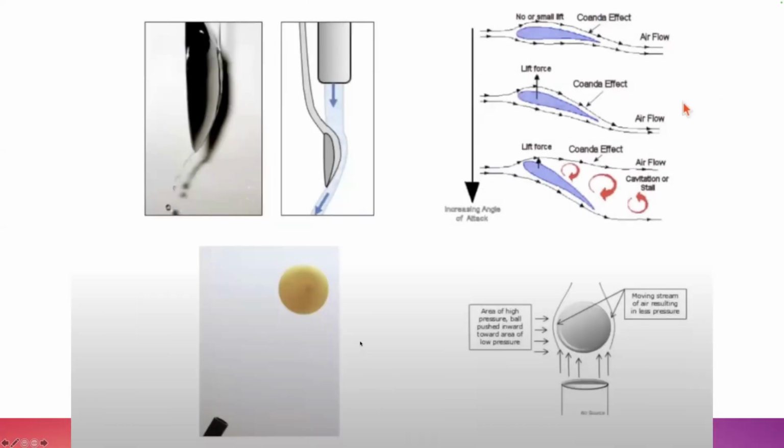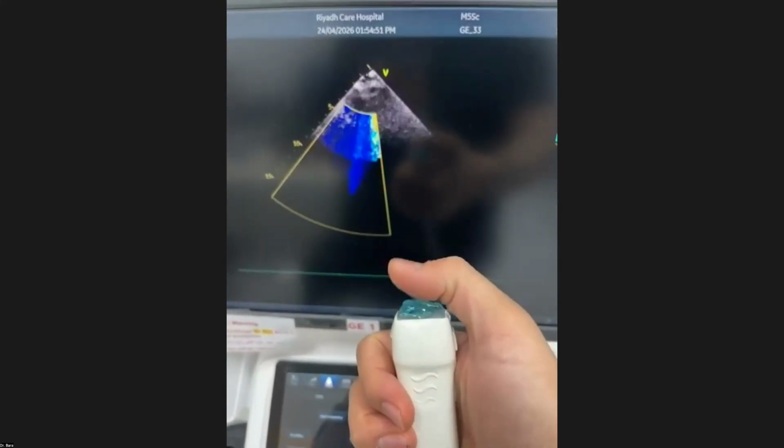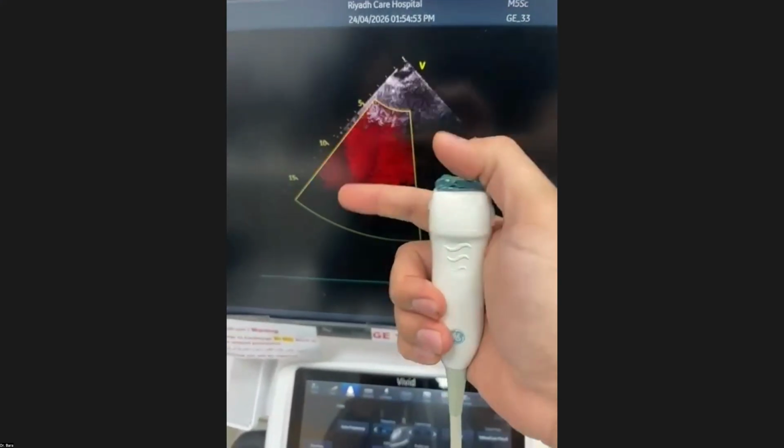So why is it important? Because sometimes it underestimates the mitral regurgitation. Because gel is technically a form of fluid, so now I'm able to cause back and forth fluid movement. Yes, so you need a medium that will transfer the sounds.